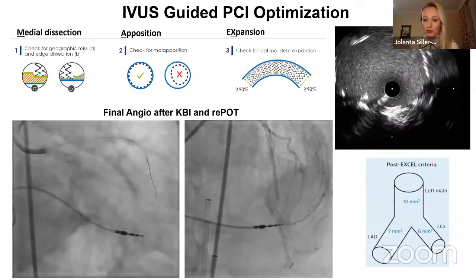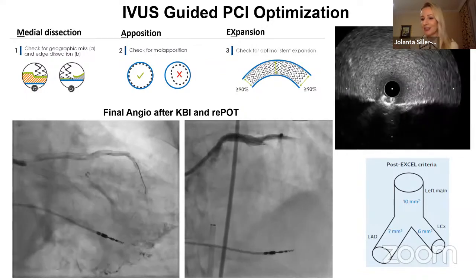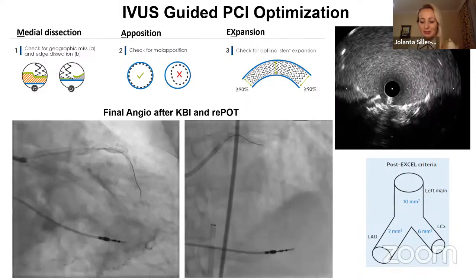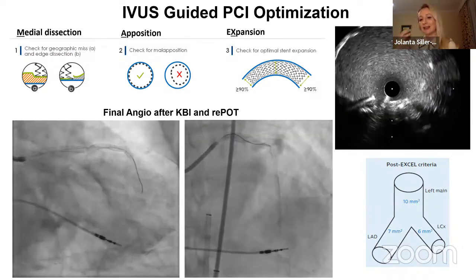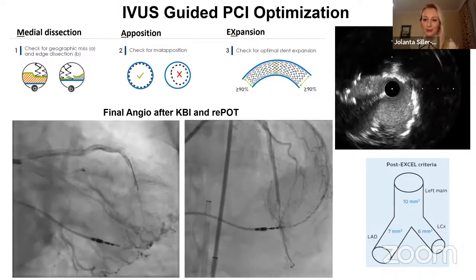But due to the contrast media volume used, the patient in several cases became hemodynamically unstable, having pain and so on. So for some reasons, I did not perform this post PCI imaging where the angiographic result was satisfactory, although I always aim to do this.